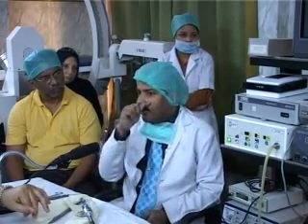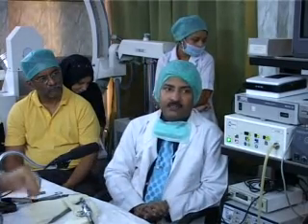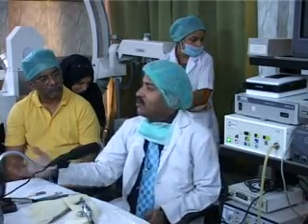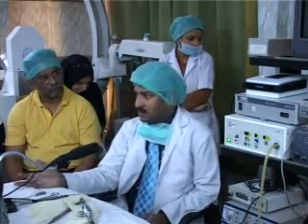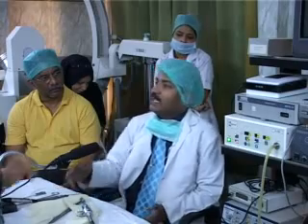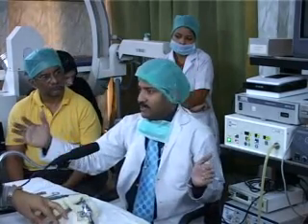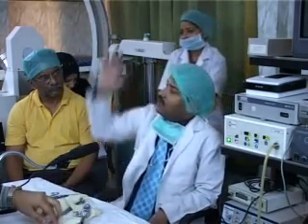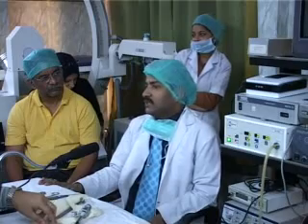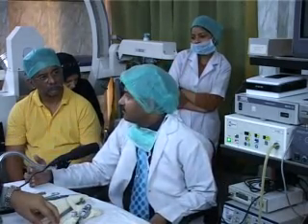Now what are the variables? Why in some patients do I need only 1.5 liter and why in another group of patients do I need 6 liter? What are the variables? The first variable is the size of the patient itself. If you have a small patient, then you need less gas. If you have a very big, tall, 6.5 feet patient, then you need maybe 6 liter of gas because the size is big.